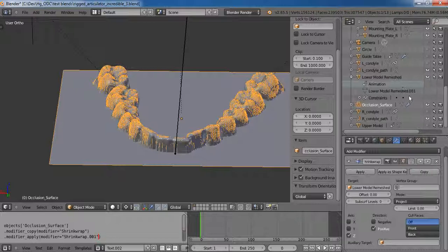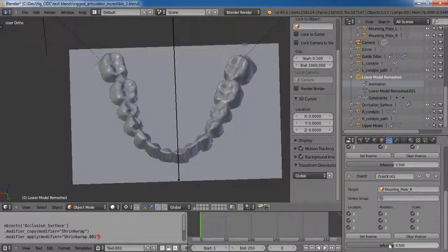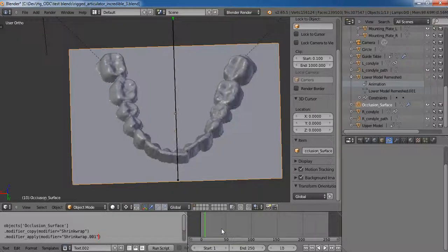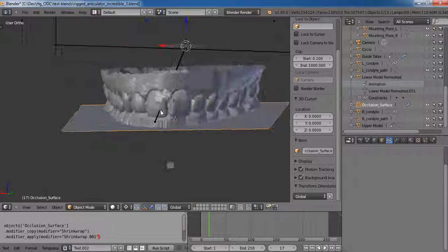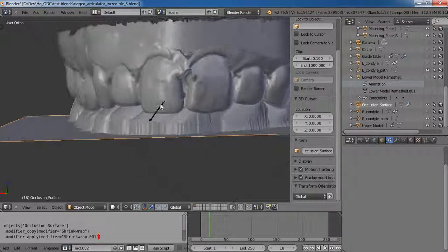I'm going to hide the lower model. Alright. And then what we want to do is record this at every step along the way. Just make sure, good, these are balanced like they're supposed to. Okay, so I haven't quite scripted this yet, but I run this, advance the animation. There we go. We can use this to make tracks in the snow. As you can see, we're already well outside the envelope of motion.